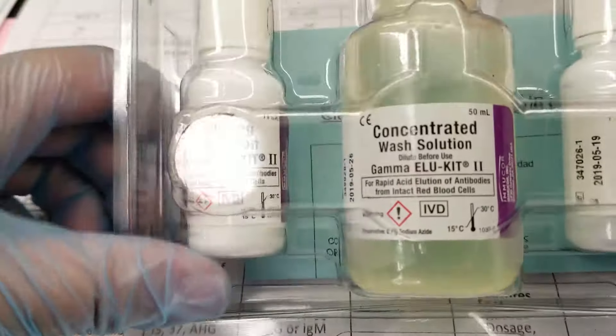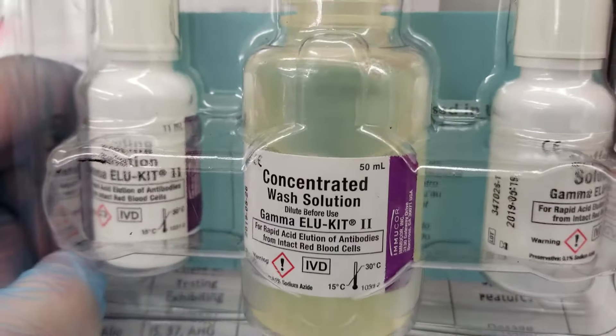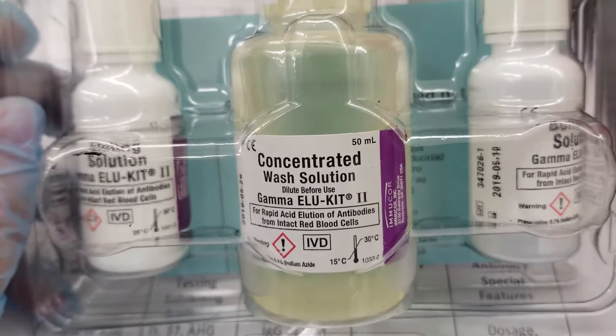The first thing we've got to do is make the wash solution. It's going to be good as soon as we make it — it will be good for six months as long as it's refrigerated and not turbid. So I'm going to get that started.